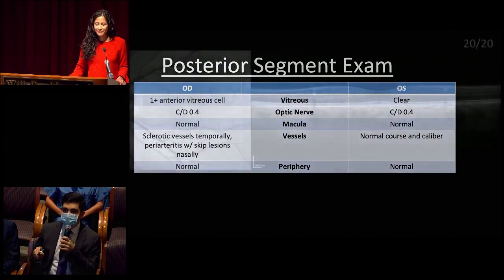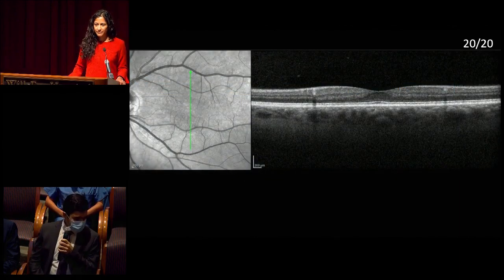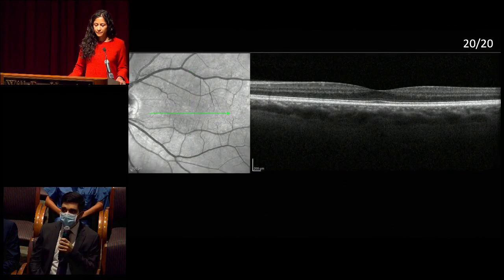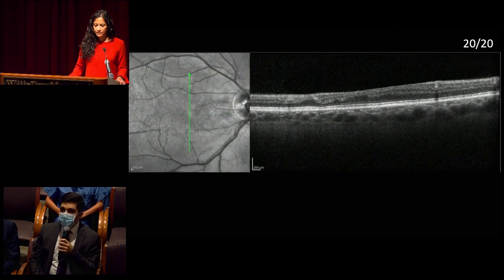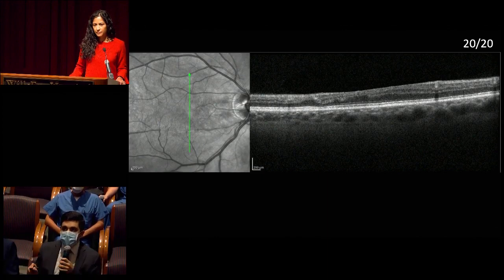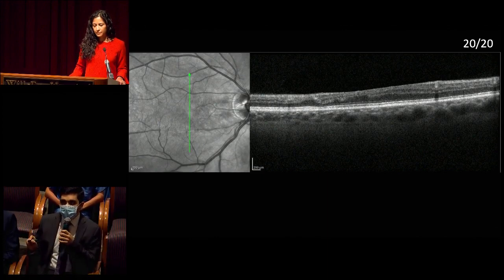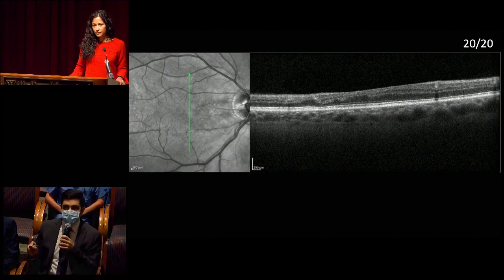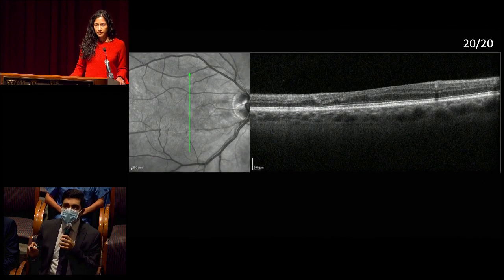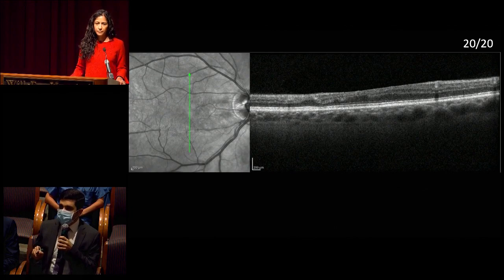On the previous OCT, those areas of inner retinal atrophy are suggestive of a potentially ischemic or microvascular ischemic insult — like one would think of with an old PAM lesion. If ischemia were present, you would expect retinal atrophy to develop in the inner retina. There is actually a new paper in Retina describing old PAM lesions, from Russia, and it looks exactly like this.